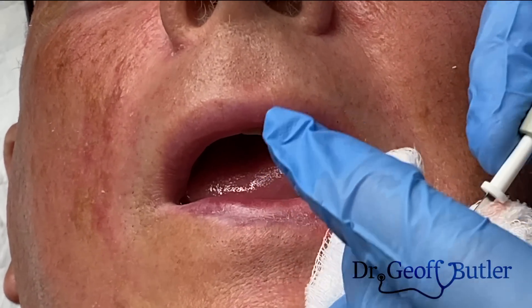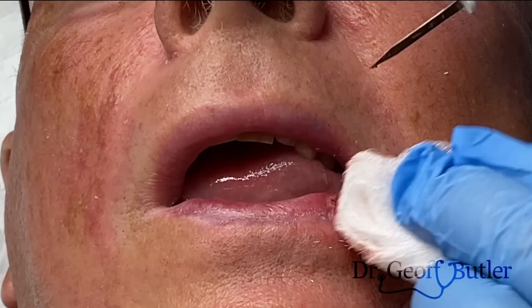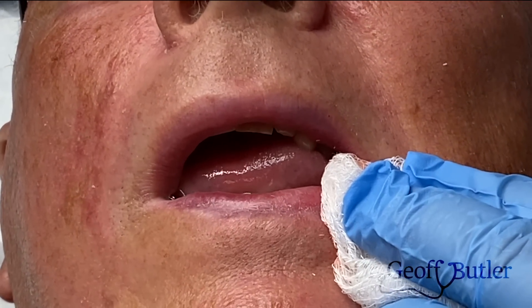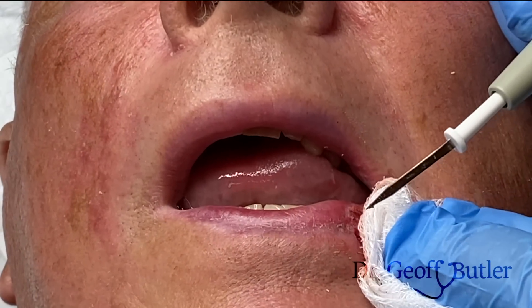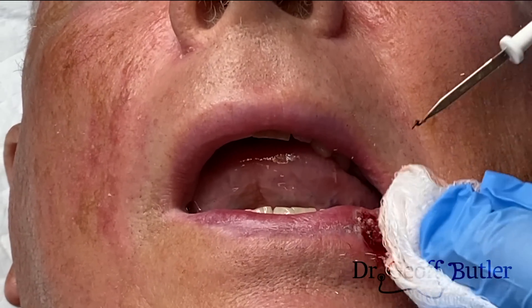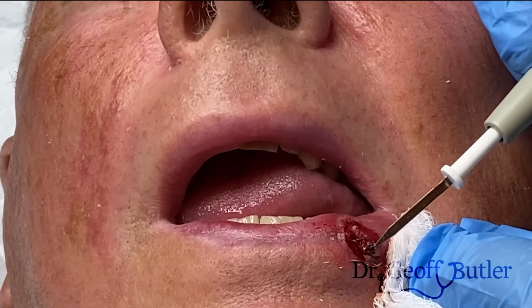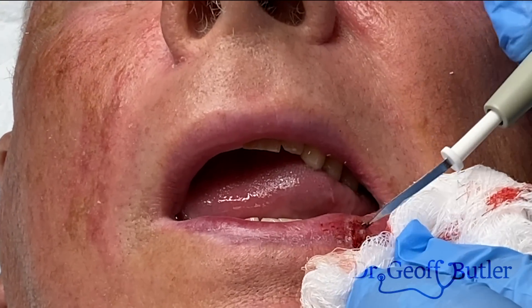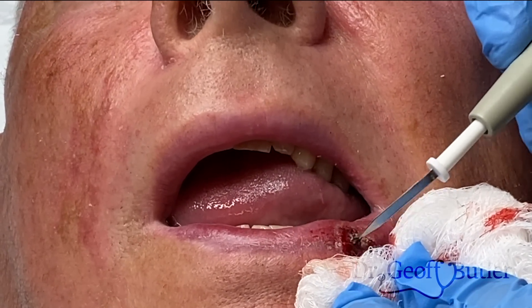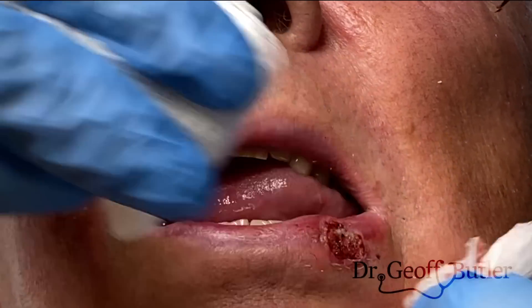I talked about this in other videos — depending on how it cauterizes, you can tell if it's normal or not normal tissue. Cancerous tissue or warty tissue is very friable, so it breaks down. This is why here I want to have just a balance where I'm taking off some of the abnormal tissue but really just getting this to stop bleeding. You can see how on the tip it's just breaking apart, and that's because it's atypical tissue.